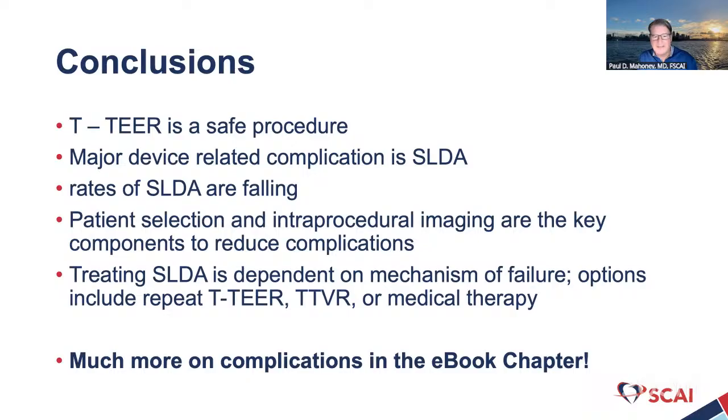Treating SLDA is dependent on the mechanism of failure, and you have options. You can repeat another clip in a strategy that you devise. You can look for another tricuspid strategy. You can pursue medical therapy. And there's much more on the complications in the ebook chapter, so I strongly urge you to go back to that ebook. And so that's what I had on complications. So thank you.